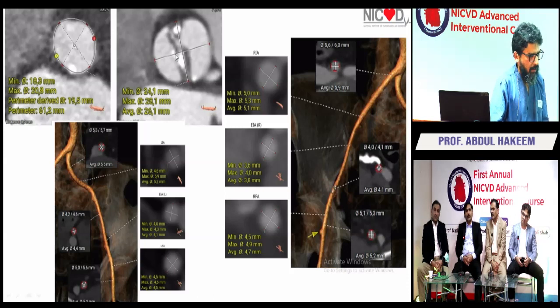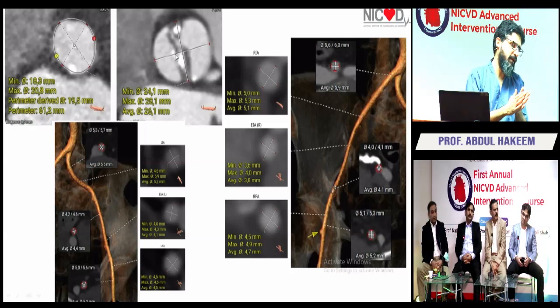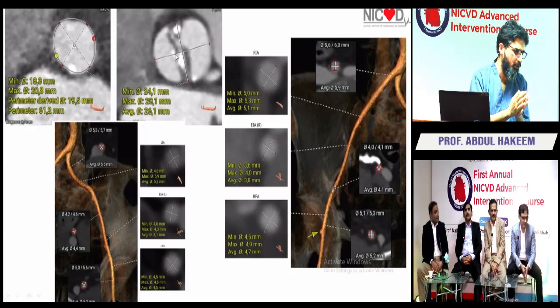Okay? All right. So in this case, we decided to go, okay, so Sohail, you said you are very gutsy, you would go transfemoral. How would your approach be different? Walk us through how you would approach this case, just for our satellite colleagues and our other colleagues. How would you use your standard 2 pre-closes or 1 pre-close, or you want pre-close?